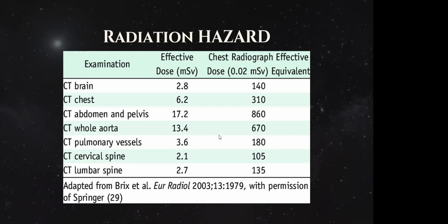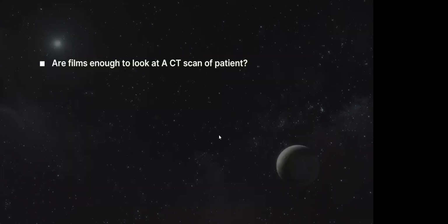And the other question I am frequently asked is, is CT brain safe for pregnant ladies? It's completely safe for pregnant females, but you have to use a lead shield on the abdomen. You can even perform a CT KUB given the circumstances and the stage of the pregnancy, if organogenesis has passed and everything.